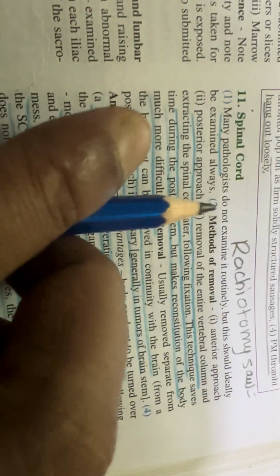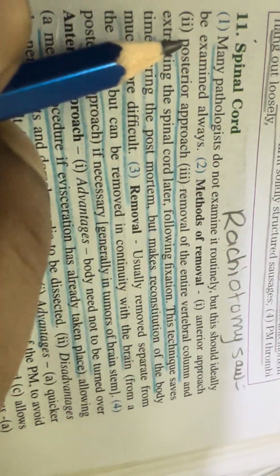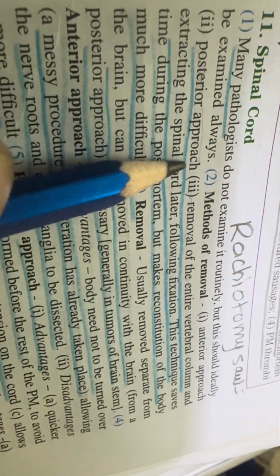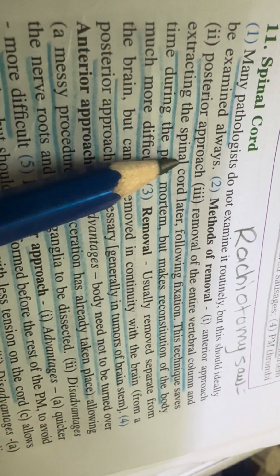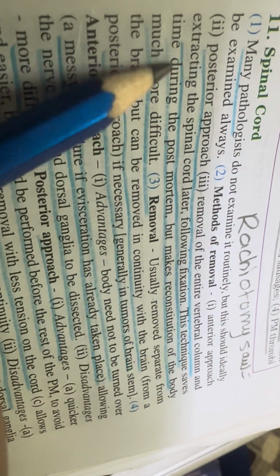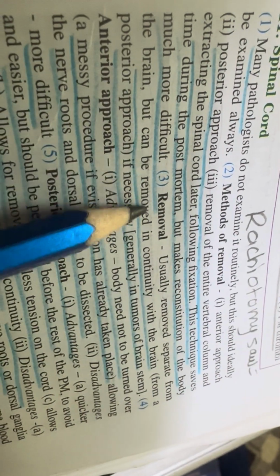Spinal cord dissection. Many pathologists do not examine it routinely, but this should ideally be examined always. Methods of removal: anterior approach, posterior approach, removal of the entire vertebral column and extracting the spinal cord later following fixation. This technique saves time during the postmortem but makes reconstitution of the body much more difficult.